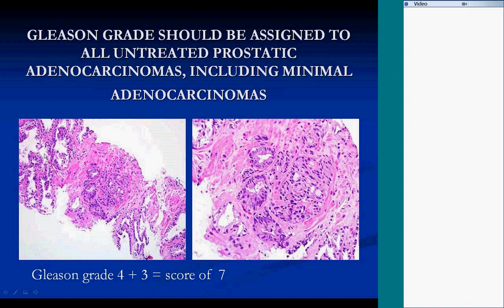Here you can see benign glands in the needle core on the left-hand side with some atrophic features lower down in the core, and there's adenocarcinoma that stands out in the middle of the needle core. And you can see that it is possible to recognize two different patterns, even within minimal or limited adenocarcinomas within the prostate. So here, there's a combination of a classical Gleason pattern 3, single separate adenocarcinoma glands, right next door to gland fusion representing classical Gleason pattern 4 high-grade adenocarcinoma.